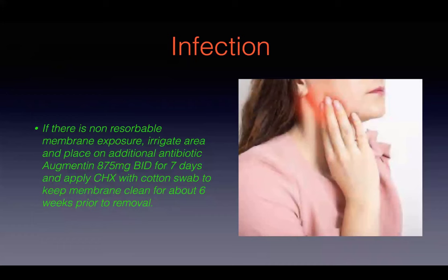I have used titanium reinforced membrane during GBR. In my hands, my results are pretty predictable for horizontal gains. For vertical, yes, I will use titanium reinforced membrane.